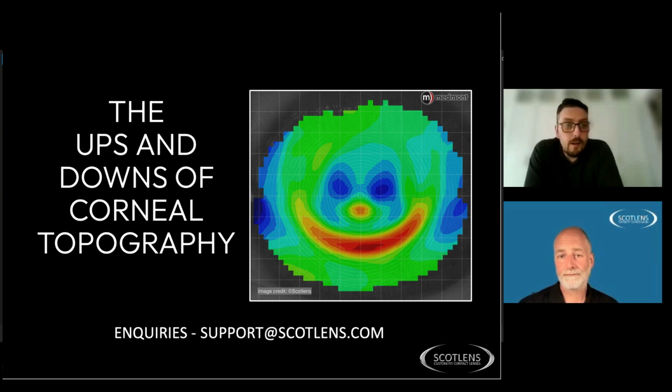Perfect, thank you. I think that answers the other question as well about the maximum myopic Rx for ortho-K. You can get it higher, but to get the best results, I don't really recommend it. I've got a few patients at -6, -6.50. Beyond that, it's not really the appropriate correction, because we can only change the epithelial cells.